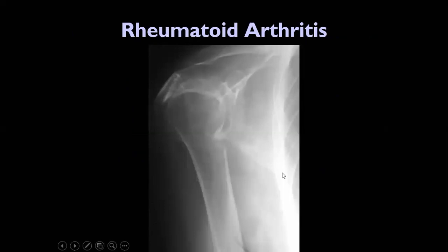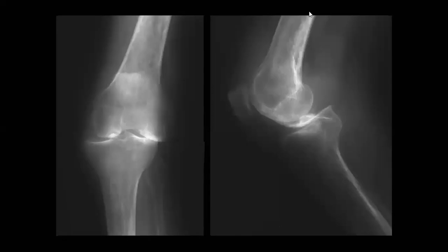Perfect. Again, with another appearance, search for erosions. If you find erosions, you are going more with that. In the MRI, you will do post contrast and you will find enhancement and synovitis, so it will be easier, right? Again, the history will be the key.